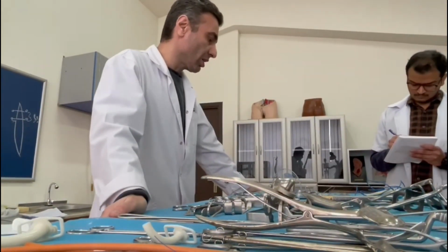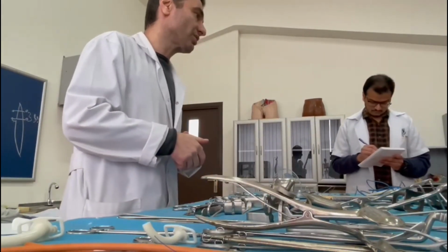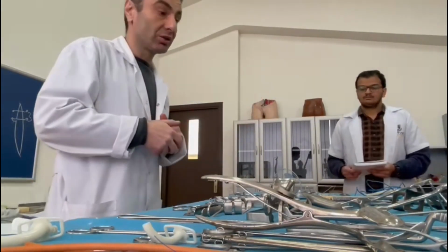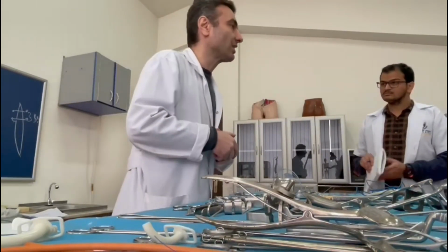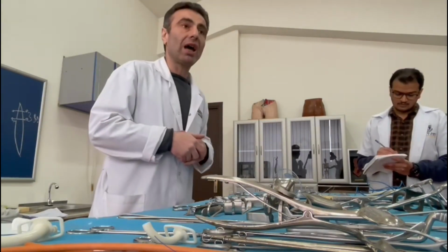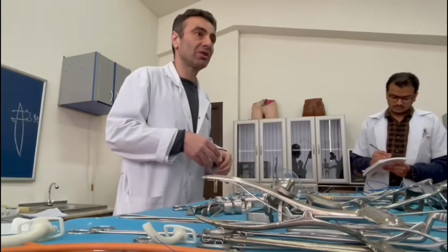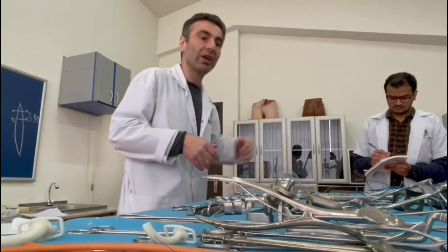As I said before, we have 5 groups of surgical instruments, and inside each group we have instruments with some same characteristics. Group number 1 of surgical instruments we call surgical instruments for disconnection of the tissues. Another way we can call these instruments is sharp surgical instruments, because using these instruments I can disconnect or cut the tissues of the human body.